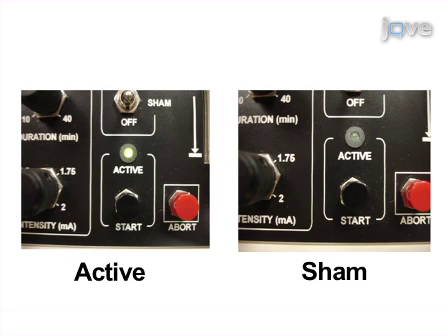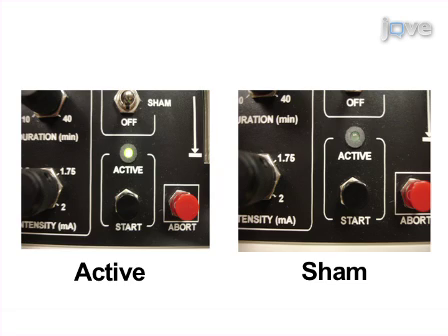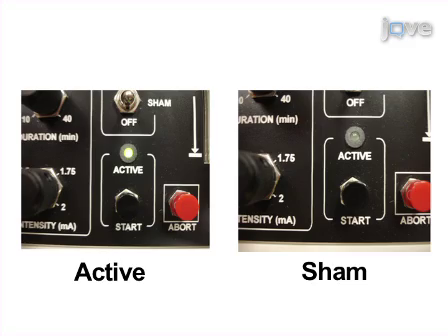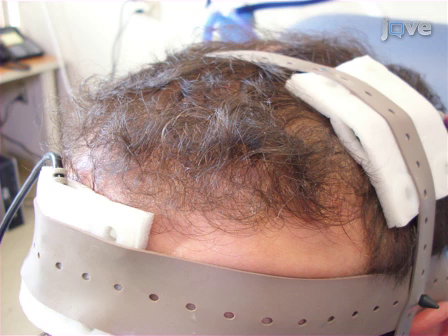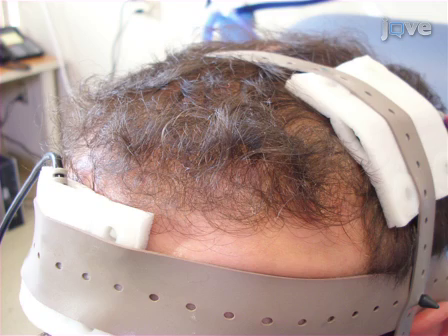With proper setup, the tDCS device should indicate that current is flowing during active tDCS stimulation, or the device should display sham mode when running a sham stimulation procedure. Of note, even with the device indicating that current is flowing through the system, current might be shunted through the skin. In order to avoid this, it is recommended to have sufficient distance between the electrodes. According to modeling studies, we recommend this be at least 8 cm when using 5 x 7 cm electrodes.